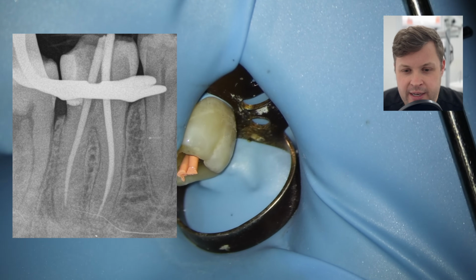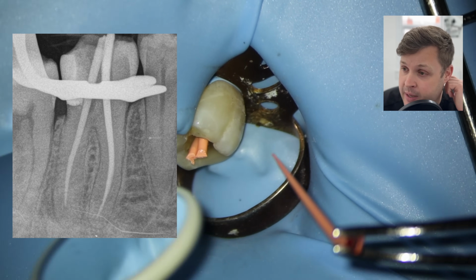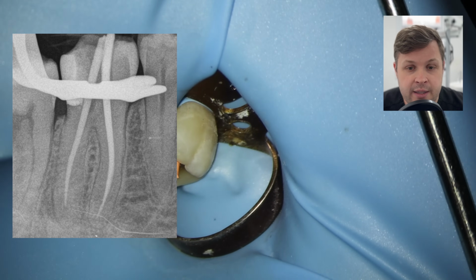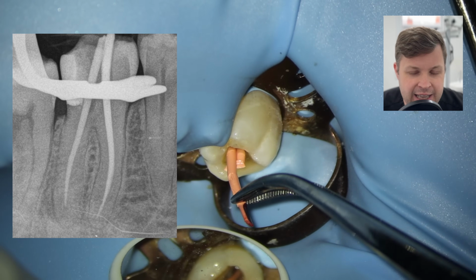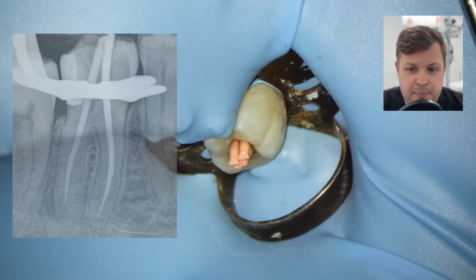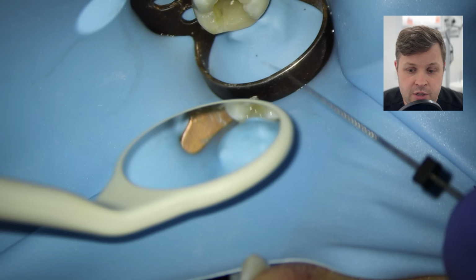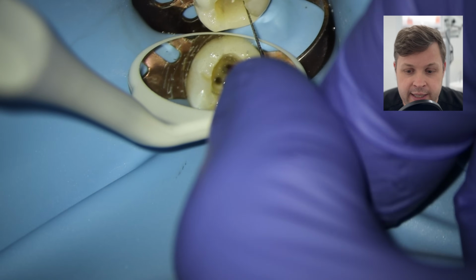So when it's maybe 1 to 2 millimeters away from the radiographic apex, you can suggest that maybe this is at the correct working length. However, I feel like in this case it's just a little bit too far away for comfort. So the best thing for us to do is to take the cones out. We're going to re-irrigate, and I'm going to just recheck the working length.